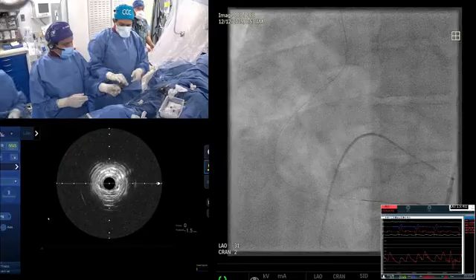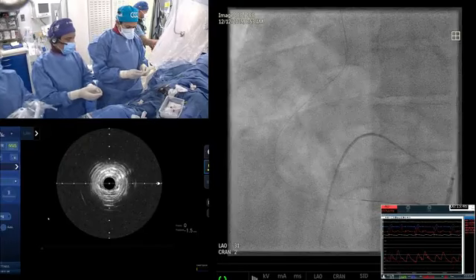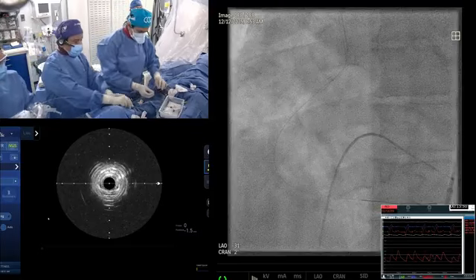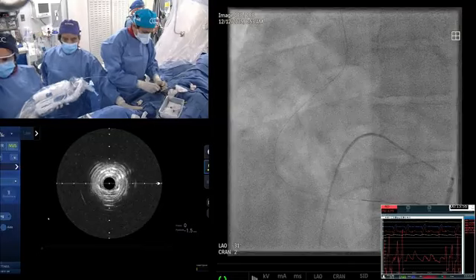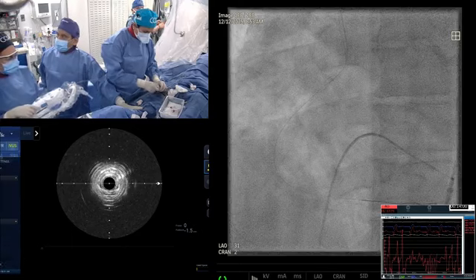Is the key on the distal lesion also? Yeah. We can remove the rotor if you don't need it. No, it's okay. We need it. Things will not go easy. Oh, it will go. Now it will go. With the burr of 1.75, 100% will go. Guide is not the best guide. Trust the 1.75 burr. It will fly.